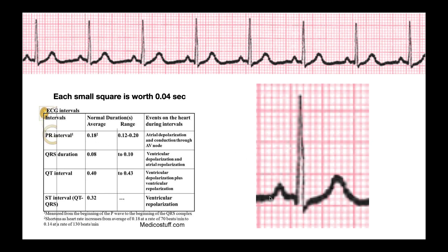So first, let's do the PR interval. Remember the PR interval starts at the initiation of the P wave and goes to right where we start deflecting downward to the Q. So right there is about where I would terminate this as the PR interval. So that green bar right there, that to me looks pretty accurate. Now also remember that each small box, and I know it's a little bit blurry here, but each small box is worth 0.04 seconds. So all I do is I count the number of boxes and multiply by 0.04, and that gets me my time. So if I start right here, here's one box, two boxes, three, and then right where this starts deflecting downward, that's about halfway to the next box. So we're going to say that this is three and a half boxes. So I'm going to take three and a half boxes times 0.04 seconds per box, and I get a time of 0.14 seconds. That is my PR interval.